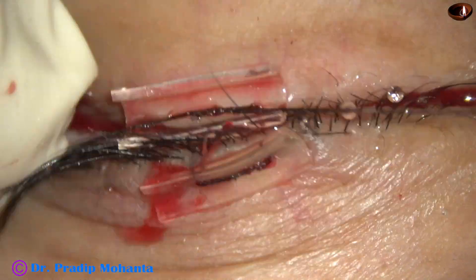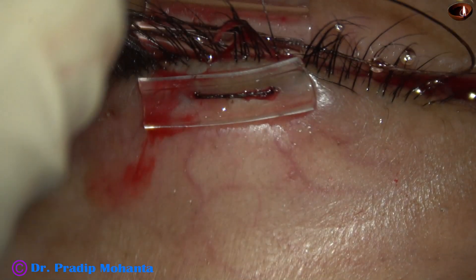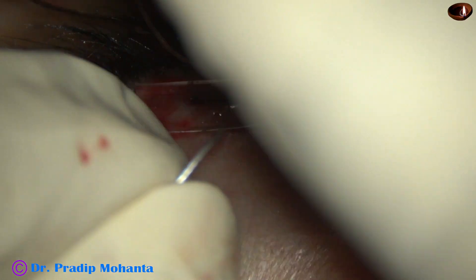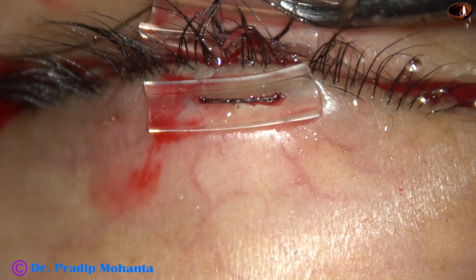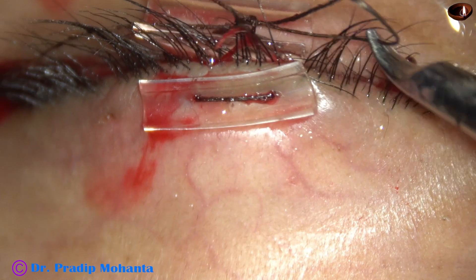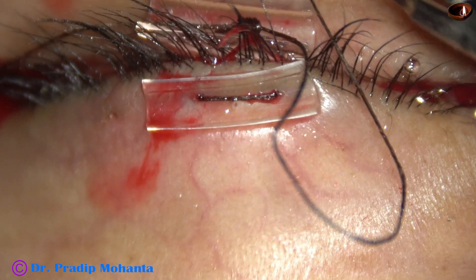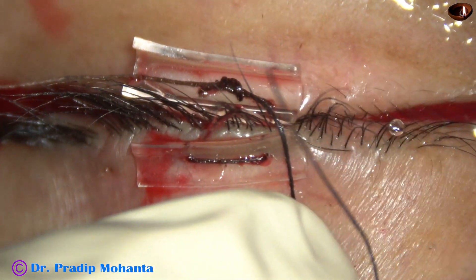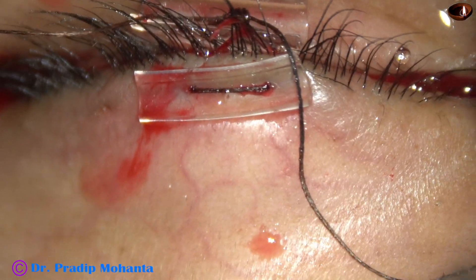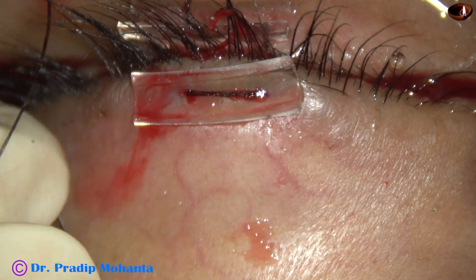I am going to place a 2-1-1 suture — that means first two throws, then one throw, and then one more throw. But see what happens in this case: as I pull this, it tears off.